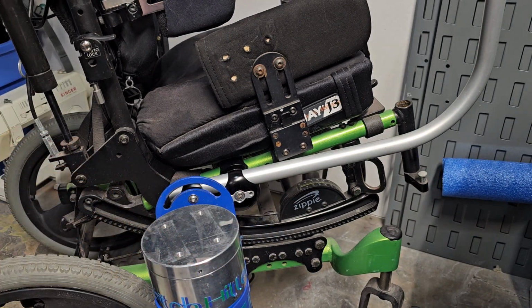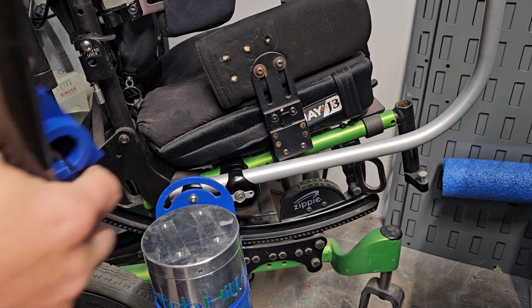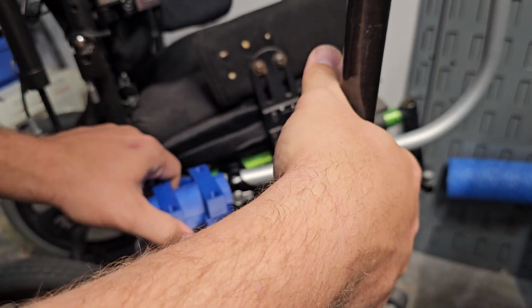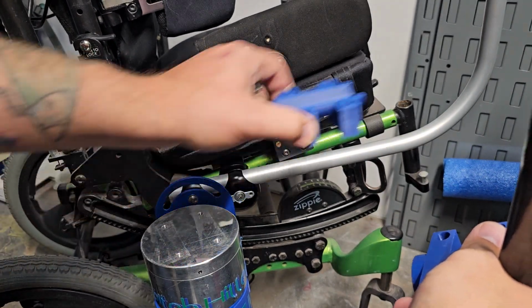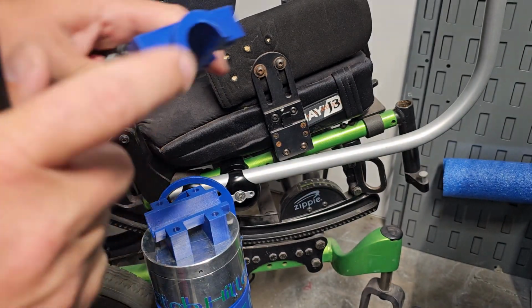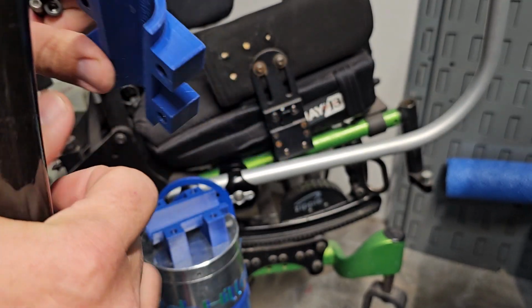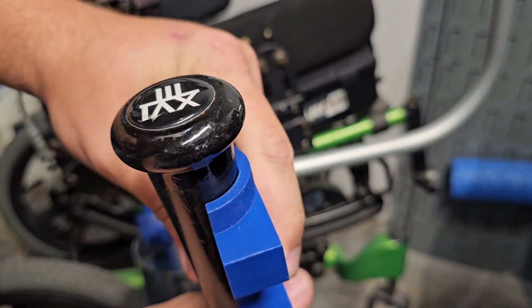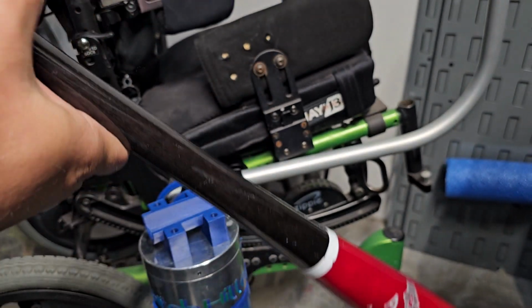Then you want to take your bat, on this, the bat's on the bottom and to the front of the wheelchair. So you got a thick side and you got a thin side. This thin side will go towards the back of the bat, where the thicker side goes on the handle.